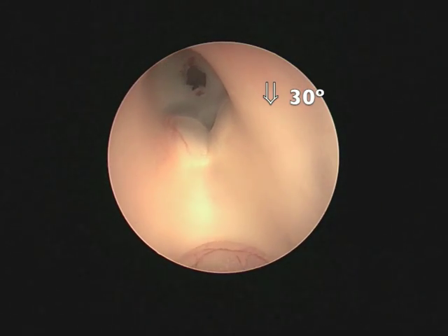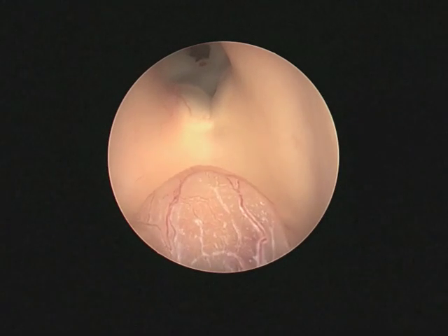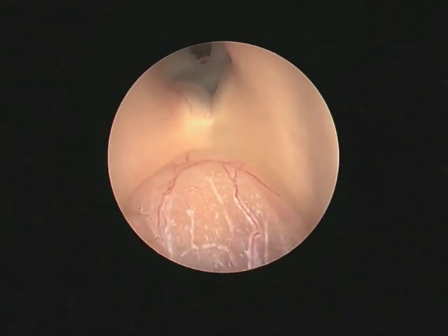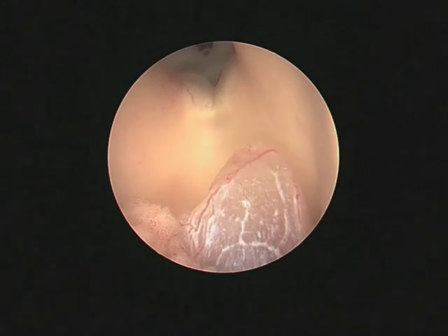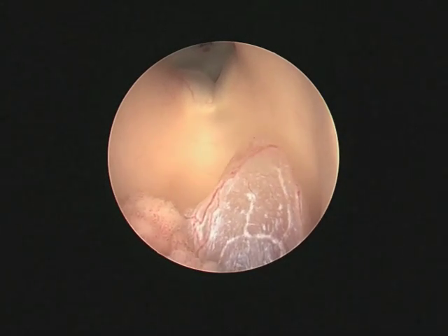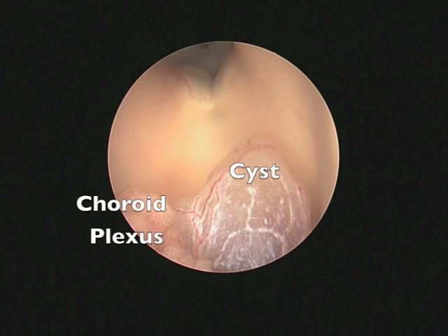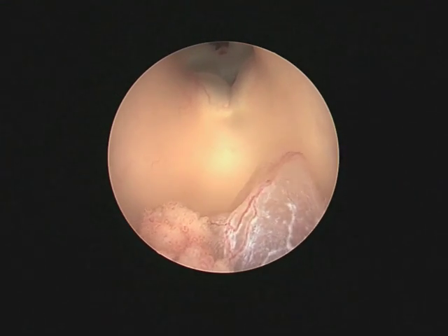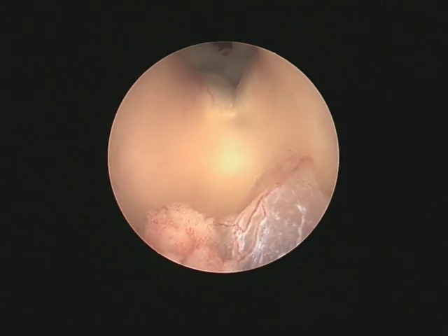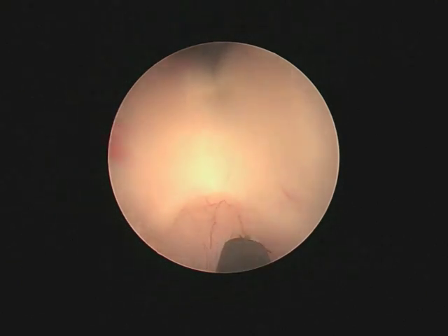Using a 30-degree endoscope pointing posteriorly, we were able to identify the choroid cyst located inside the third ventricle, closing the entry area of the aqueduct. The cyst was definitively coming from the choroid plexus, and our decision was to use a bipolar to coagulate and shrink the cyst.